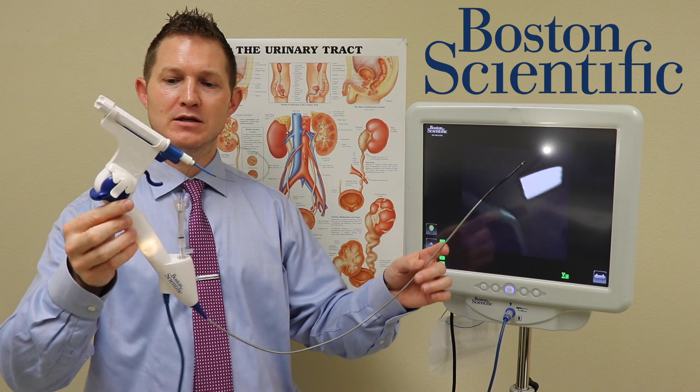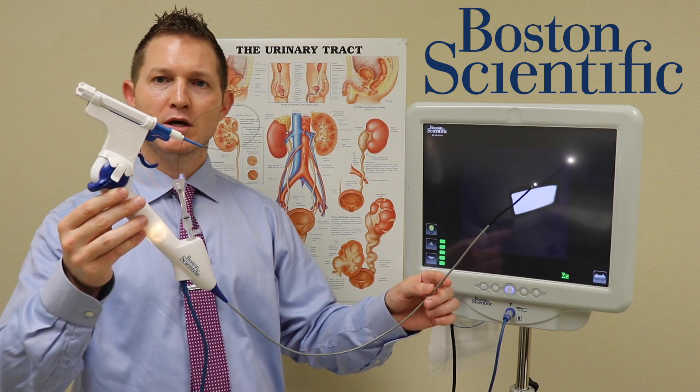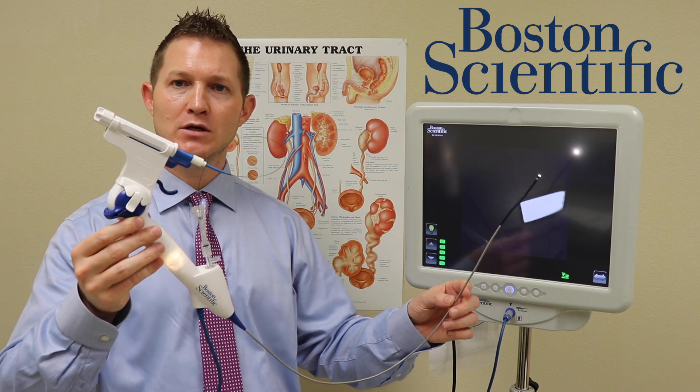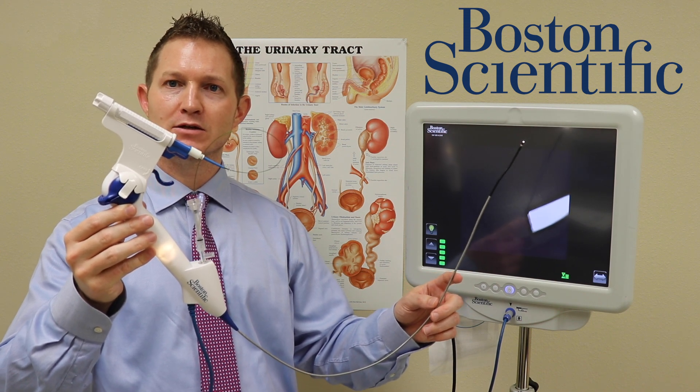This is the LithoVue device. This is a disposable ureteroscope. The advantages of a disposable ureteroscope, especially in the COVID era, are significant in the fact that this is a single-use device.